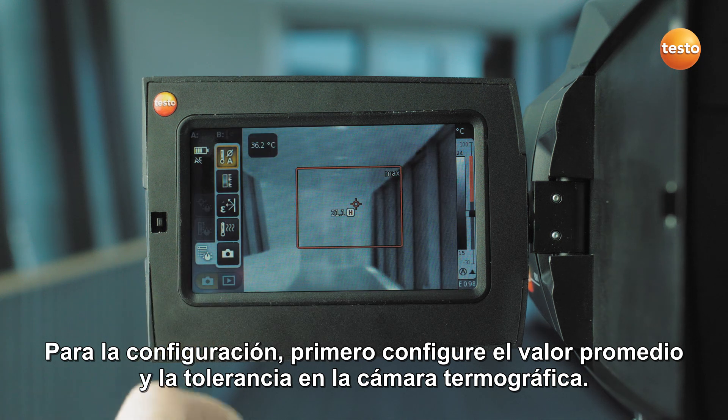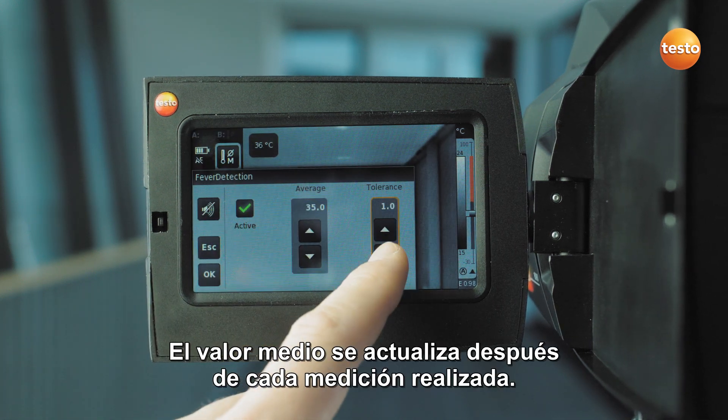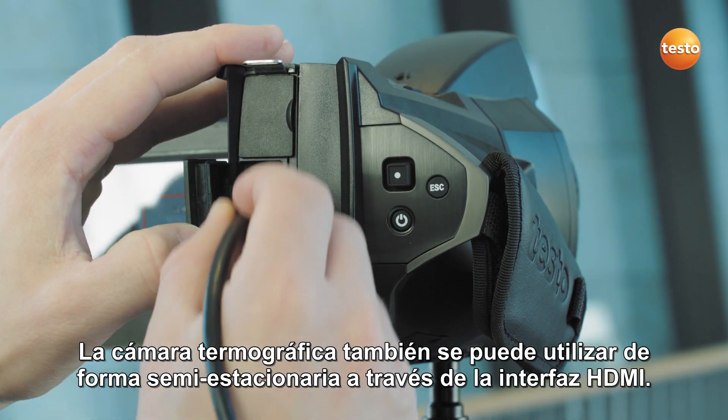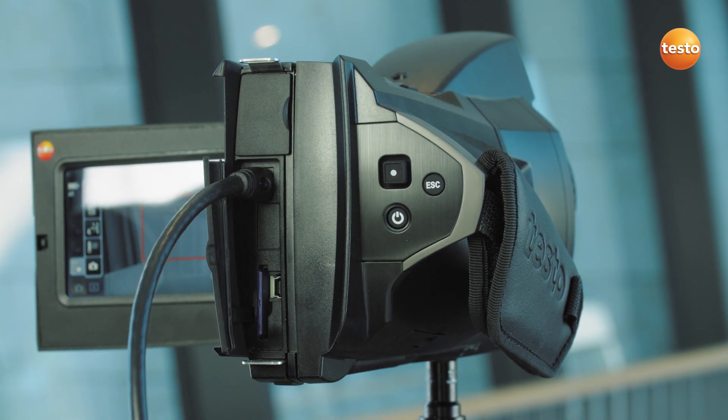For the setup, first set the average value and tolerance in the thermal imager. The mean value is updated after every completed measurement. The thermal imager can also be used semi-stationary via the HDMI interface.